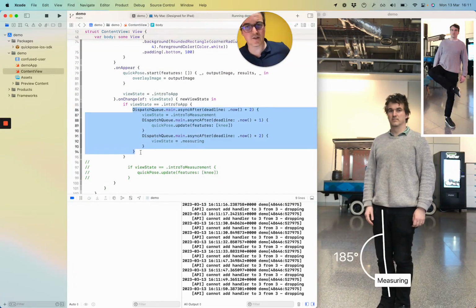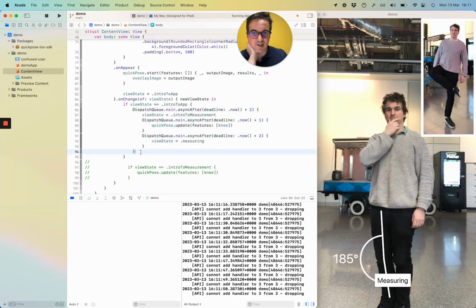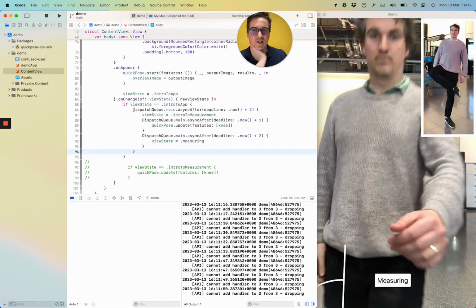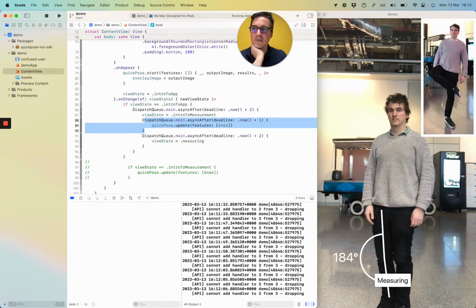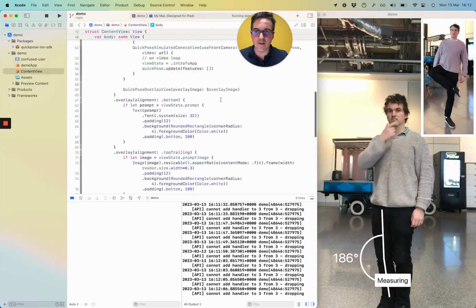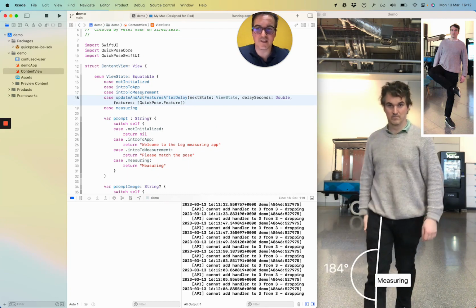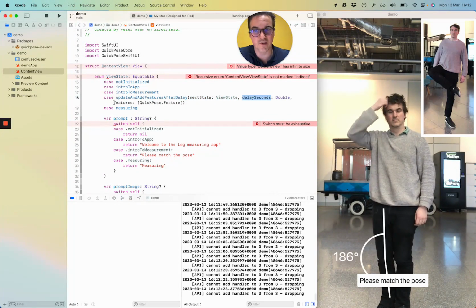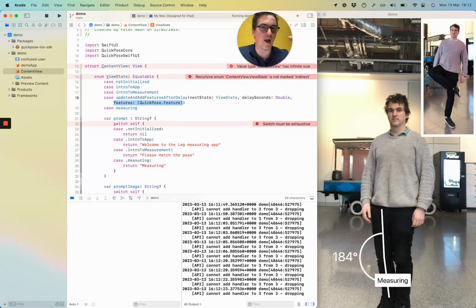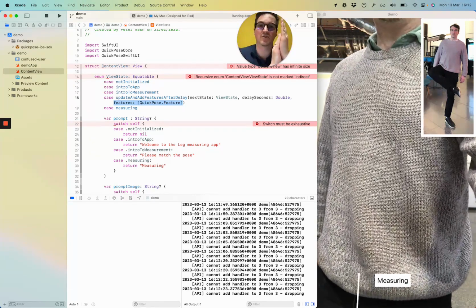Okay, so there is something I wanted to put in to tidy this up. Now it's more of an advanced feature here, so if it doesn't make much sense, don't worry. Just think of it as a way of tidying up this. So what we have here is after a second I want to change the view state, and then after another second I want to change the features. What I would do is have another state here. Now this says update and add features after delay. So it basically changes the state, but after a couple of seconds it changes the features. This allows you to say something like intro to app, and then afterwards apply the measuring angle, so the user gets progressive disclosure of what's happening. So it's not just all at once, it's like a trickle of new things.